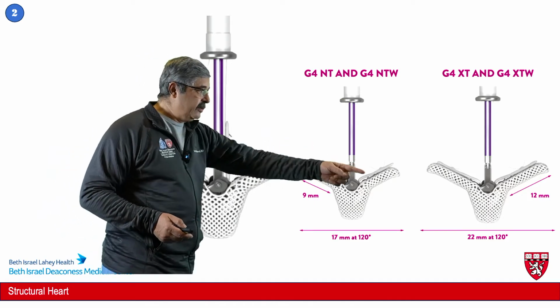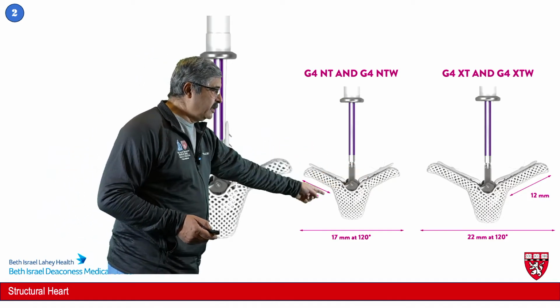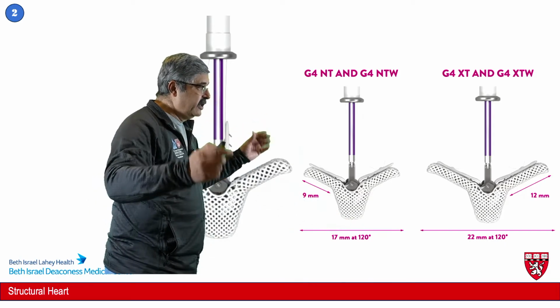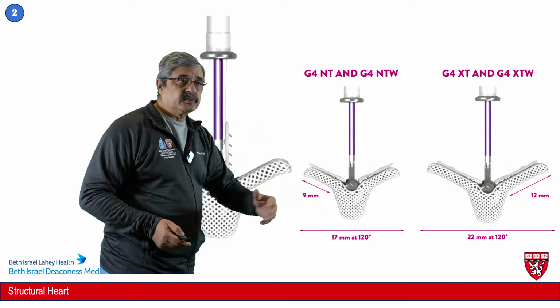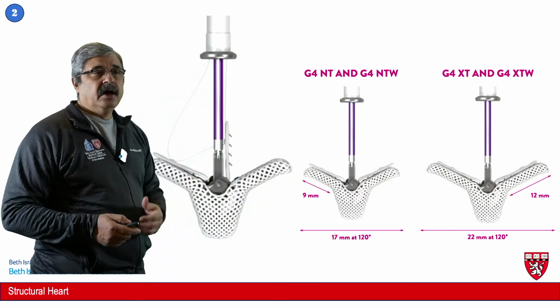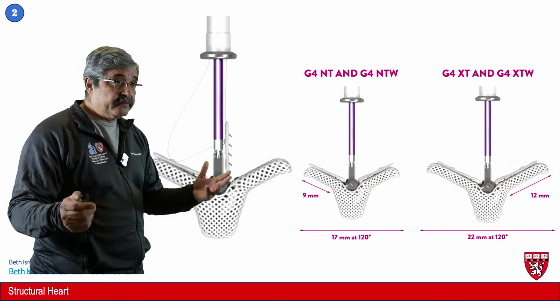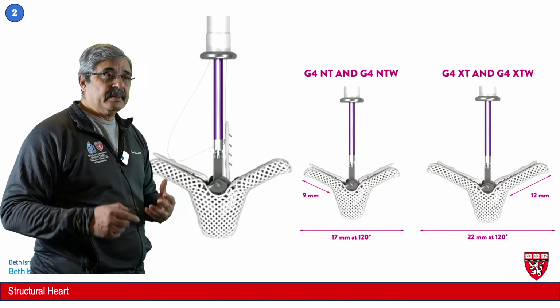XTs have 12 millimeter clip arms. This is about 9 millimeters. This grabs about 17 millimeters of a flail gap between leaflets at about 120 degrees, and that does 22 millimeters. So really, depending on how much leaflet you have available, what's the flail gap, you have an array of clips that you can choose between the two of them.